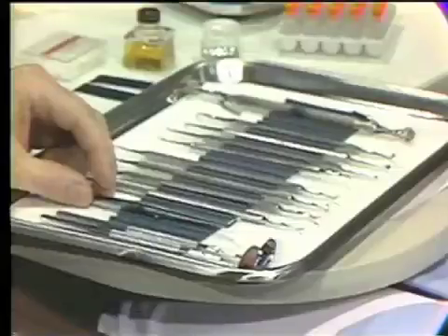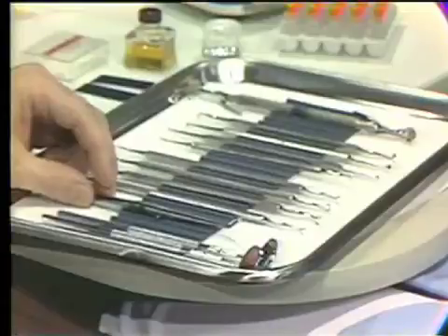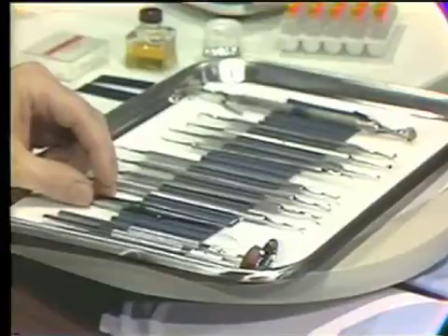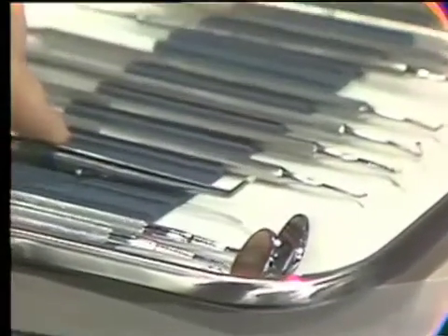Now let's take a close look at our instruments here and go over these with you to begin with. We'll try to keep the instruments used to a minimum. Many dentists medicate their amalgam cavity preparations before packing the amalgam, and we'll have you go through and place some Copalite or cavity varnish, which is the most common material, although there are many materials that can be used. This is done with a small cotton plier and some cotton pellets.